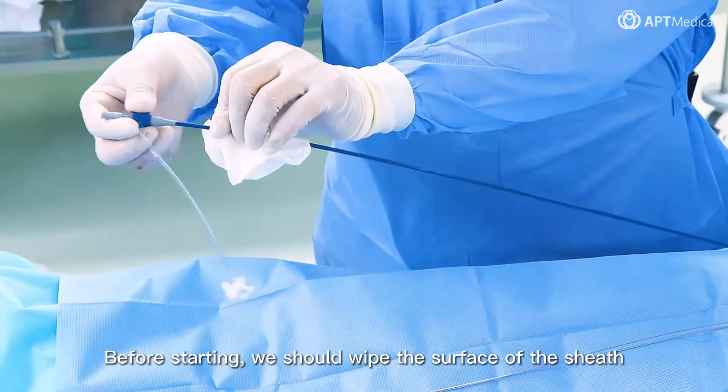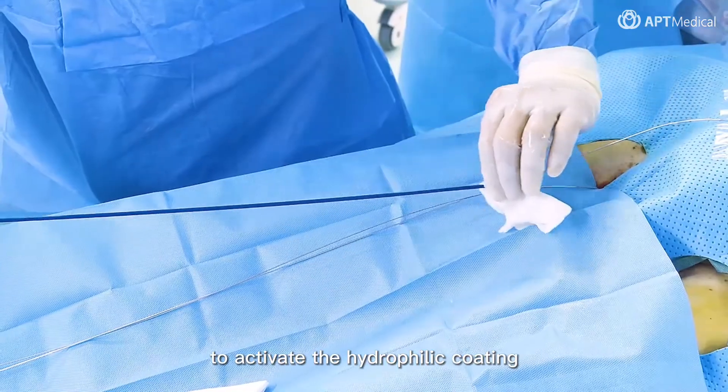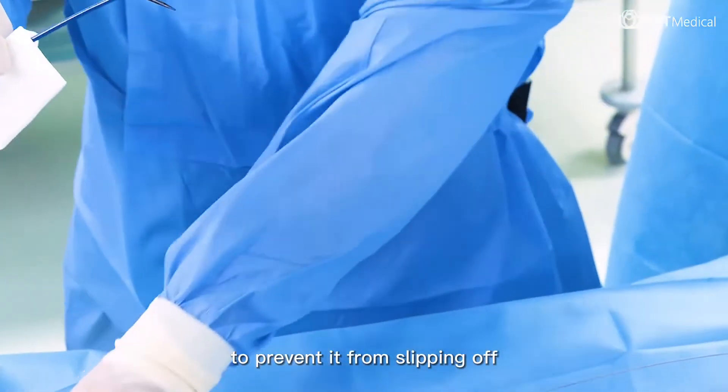Before starting, we should wipe the surface of the sheath with saline-soaked gauze to activate the hydrophilic coating. In this way, the sheath becomes smoother. When advancing, we can hold the sheath with dry gauze to prevent it from slipping off.